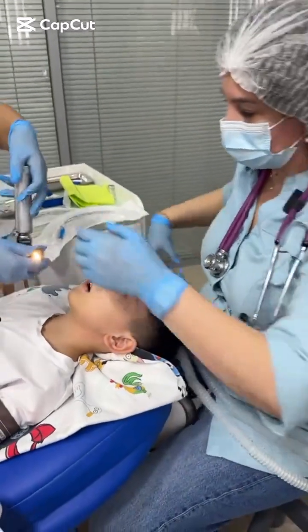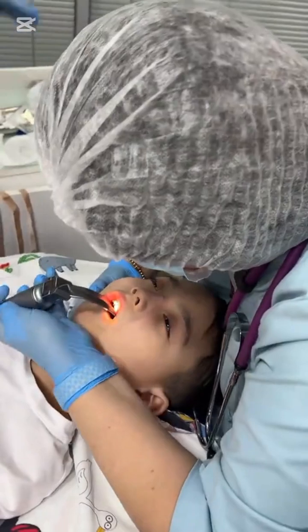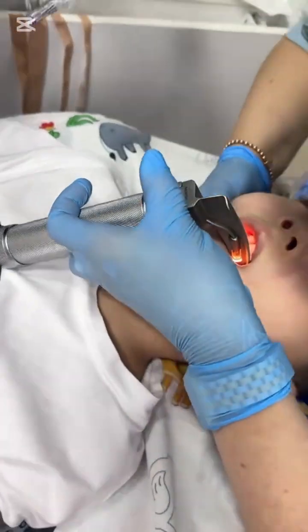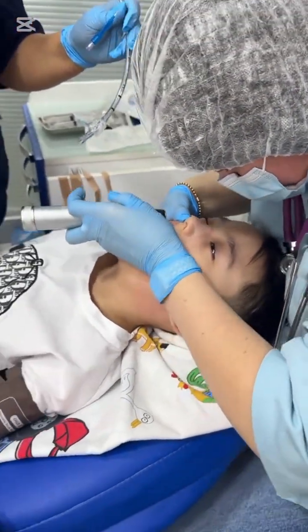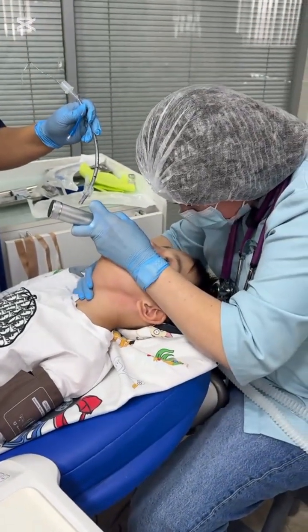Please observe this intubation procedure very carefully. We would like to engage our viewers by asking a few important and thought-provoking questions that will not only test your knowledge but also help reinforce key concepts in airway management. First of all, take a closer look and tell us: does this case appear to be a difficult intubation or not? What signs or challenges can you identify that may suggest difficulty?